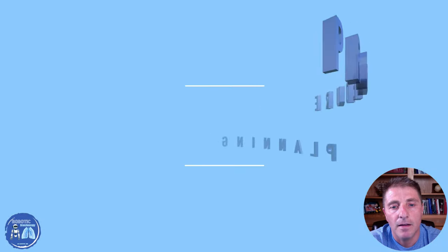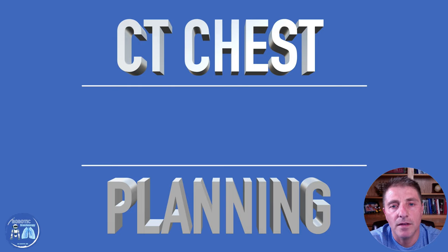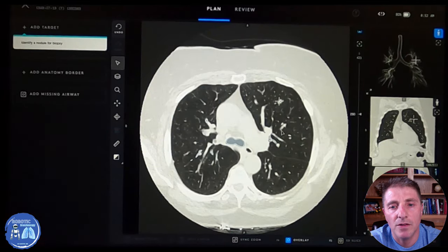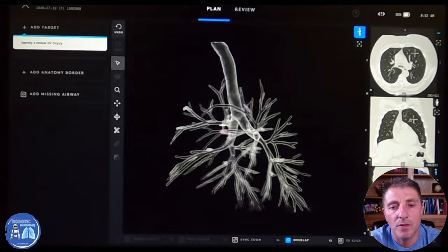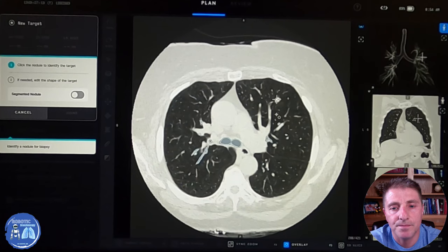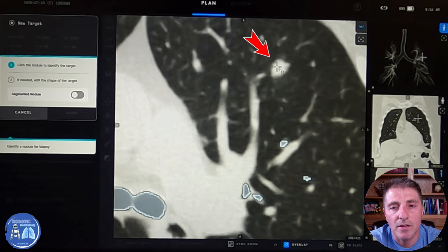The procedure is usually planned by taking the CAT scan done for the patient and uploading it on a computer with artificial intelligence to help identify the nodule. As you see, the computer will extract the airways — what we call the bronchial tree — and then we can zoom in and find our target, which is one of the nodules, as you see on this CAT scan.